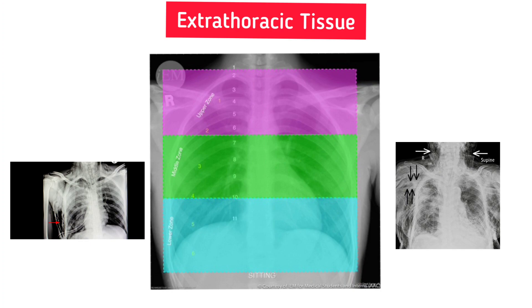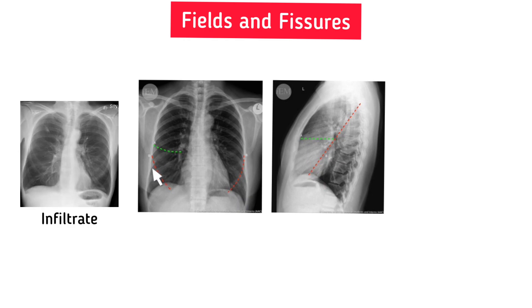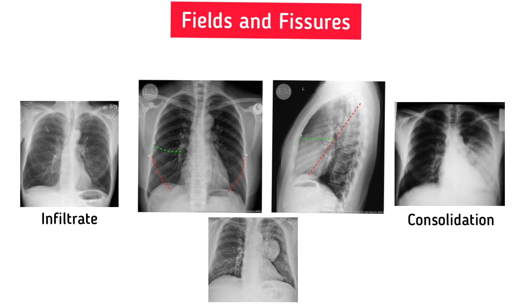Finally, fields and fissures. You should check lung fields for infiltrates, identify their location, and identify the pattern — whether interstitial or alveolar. Look for air bronchograms, nodules, masses, consolidation, pneumothorax, and vascular markings; vessels should be almost invisible at the lung periphery. Finally, evaluate the major and minor fissures for fluid collection.